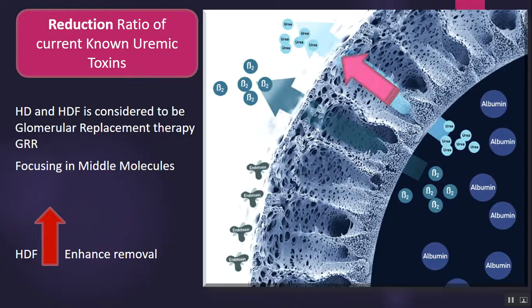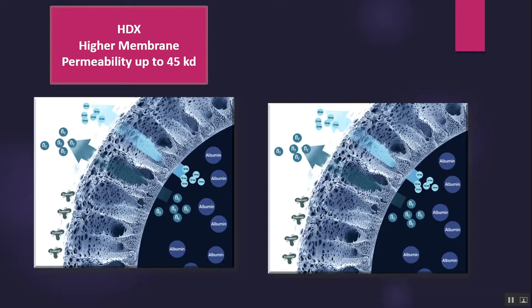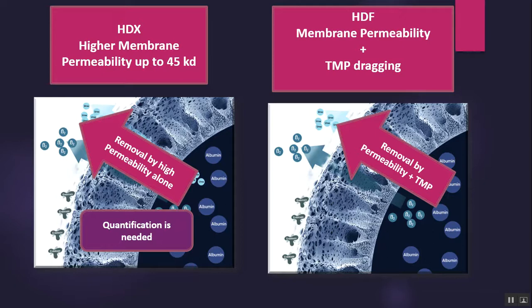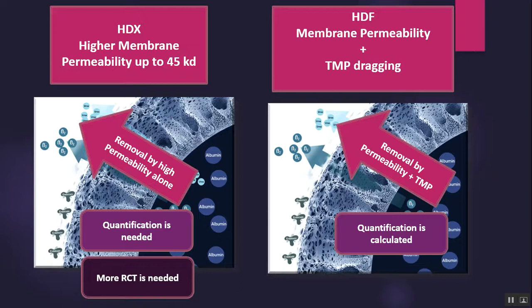HDF enhances the removal by drag forces, meaning that through the transmembrane pressure it can remove bigger molecules. While in HDX, with higher membrane permeability up to 45,000 Dalton, it can remove such molecules with only pore permeability. It is still early to document that in research, but it's going. We need more randomized controlled trials to compare between both therapies.